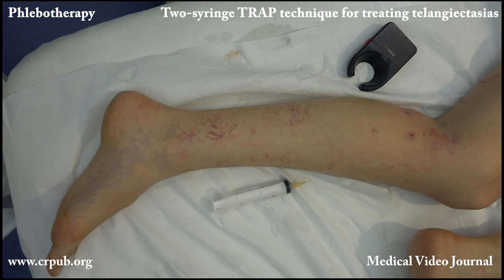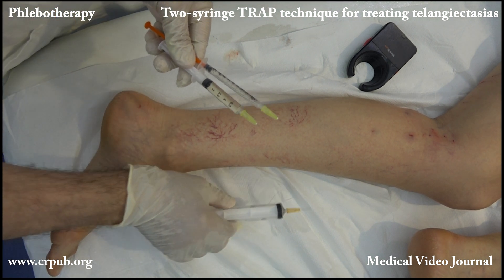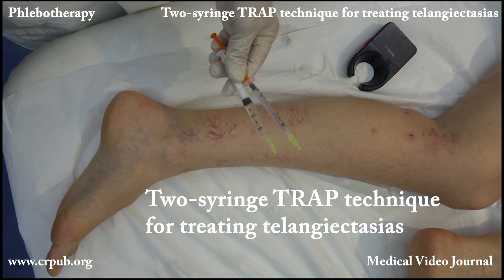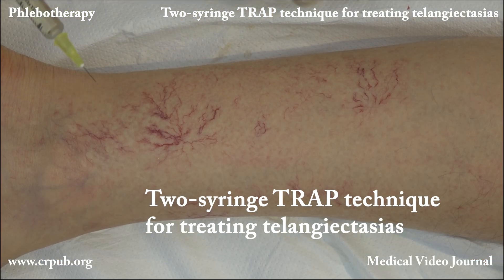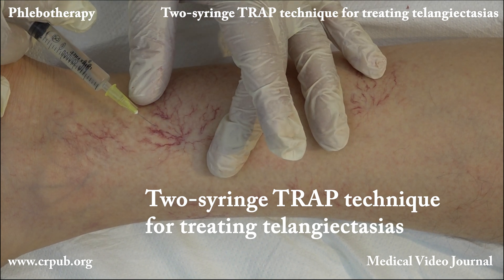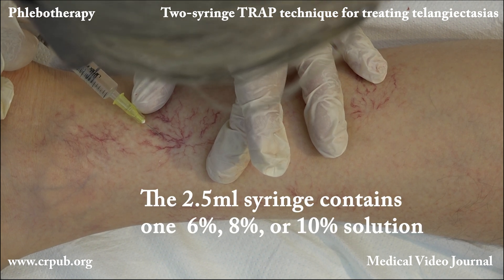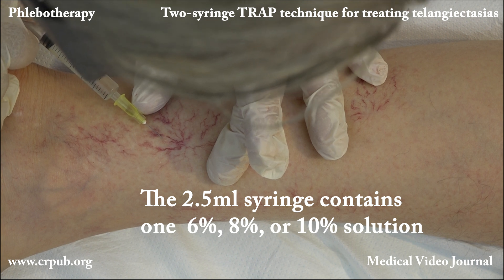If the telangiectasias are very fine and cannot be injected with the 25G needle and the 20 milliliter syringe, the two-syringe technique is used. Before using the two-syringe technique, the operator must, in any case, have corrected the hemodynamic hypertension in the limb by injecting the 3% regenerative solution into the visible veins until they completely disappear.